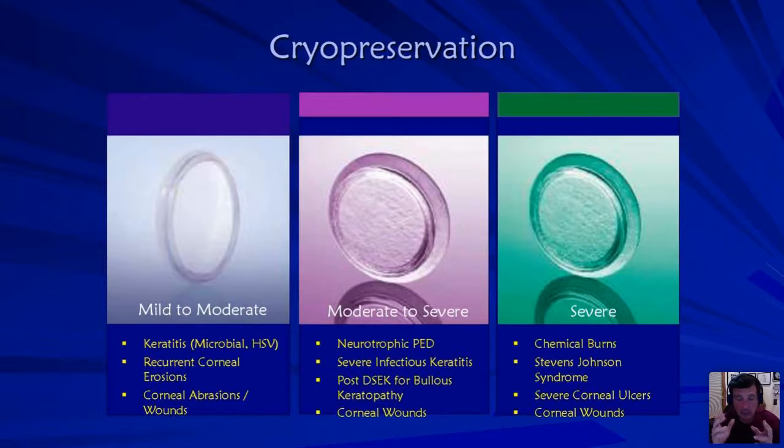The other thing that you need to remember is the hotter the eye, the quicker this membrane will dissolve. So I've used a single membrane on these patients that are filamentary keratitis, or an early to moderate dry eye where they're not responding to the therapy the way they should be. And you put a membrane on, the eye's not hot at all, and you might see them back in a week, and there's still a membrane on there.